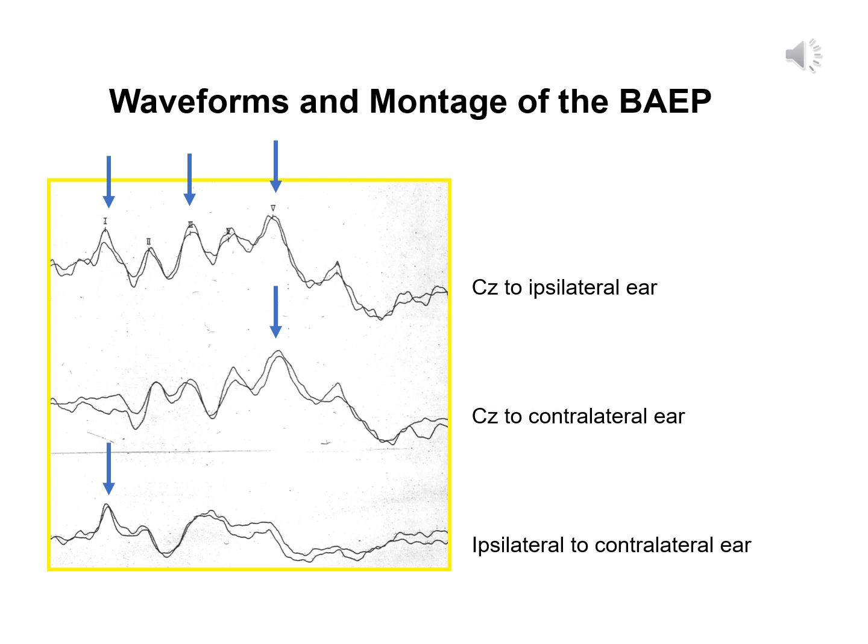And so by using the second and third montages, if the first montage is not so clear, the second and third montages can help us identify the most prominent 5 and the most prominent 1 so that we can sort of trace back to the first montage and identify what might be the 1 or the 5. This will become clearer as we start to look at some case examples.